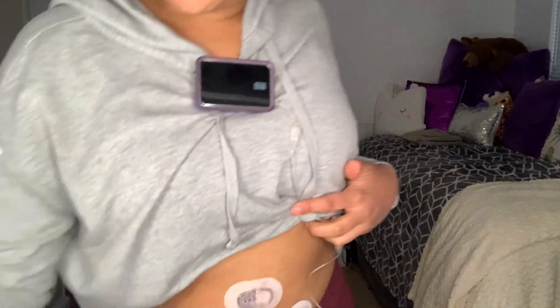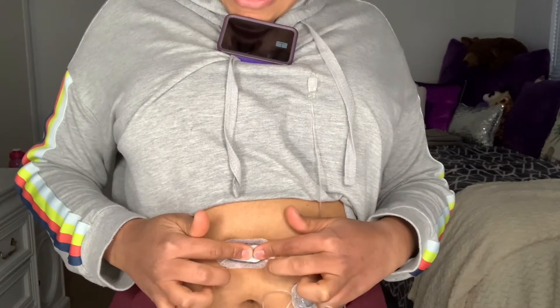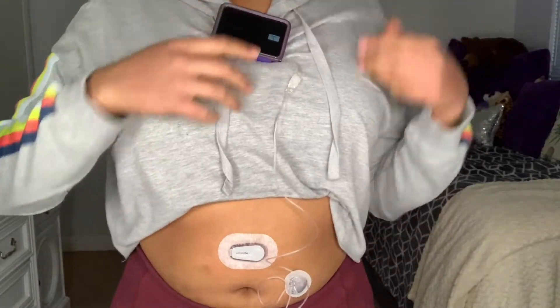Now we're going to take our transmitter and insert it in here. You want to push it down until you hear a click. So now our CGM sensor is all in. Let's go back to our pump — or your phone or whatever your device is — and press the blue check to confirm the code is ready. Then it's going to ask you, 'Are you ready to start your CGM?' and you're going to say yes.